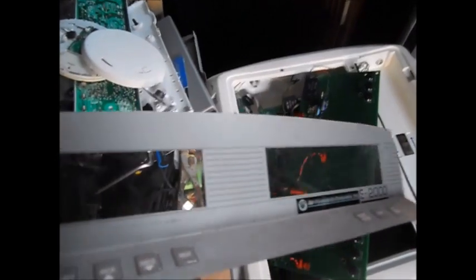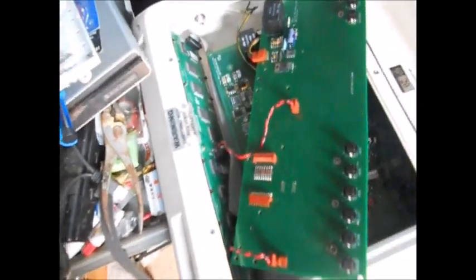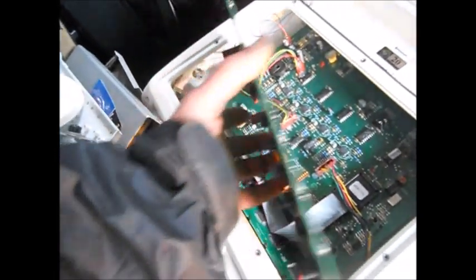thing off the front. You can take a heat gun or a little razor knife and go underneath and pull it off. And then you can pull these boards out. This one seems to have some sort of power problem. I'm not sure exactly what it is.